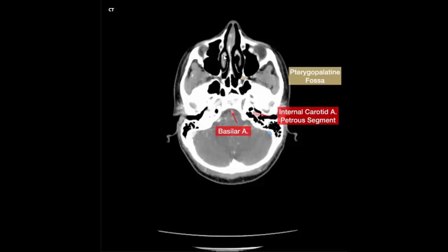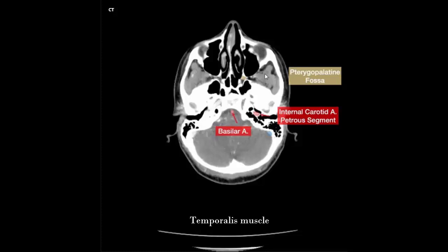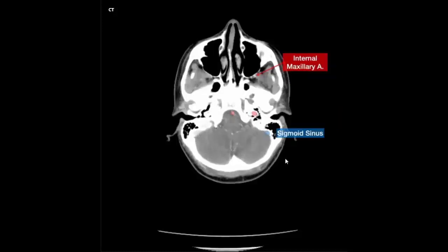Nasal septum, right and left turbinate, right and left maxillary sinus, right and left nasolacrimal ducts, right and left temporalis muscle. Right and left internal carotid artery, basilar artery. Right and left temporalis muscle, internal carotid artery, basilar artery, sigmoid sinus.